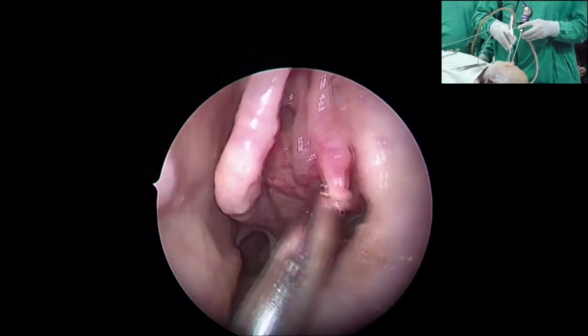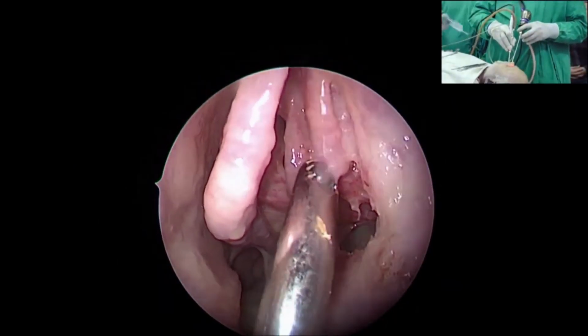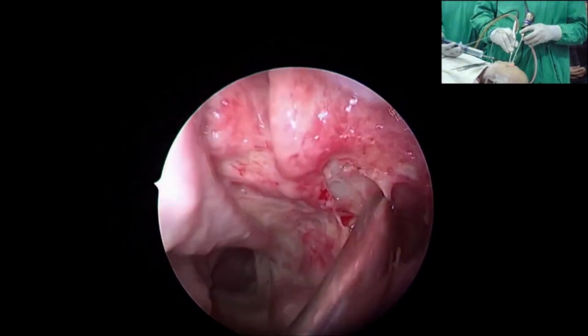But not often, if you do a retrograde with a backbiter, will the tail go away. If you do not remove the tail of the uncinate process, the maxillary ostia is never fully open. Yes. So that is a different way of doing things, but the aim is the same.